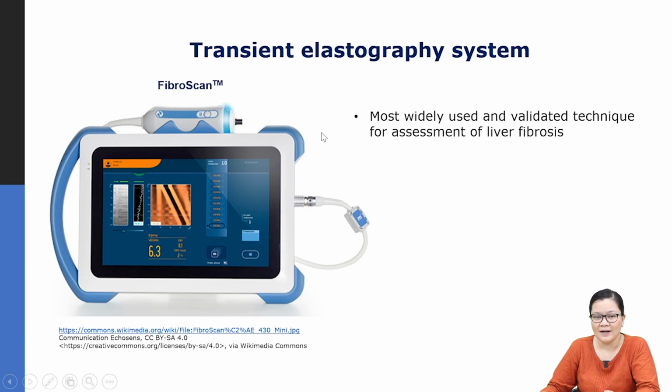And it has been a validated technique, and you can see that the system is quite portable. You can map the spatio-temporal profile of the shear wave here, and it also outputs the median elastic modulus fairly well right here. So there are many research articles, in clinical journals as well, demonstrating the feasibility of this technique, and so it's widely studied.